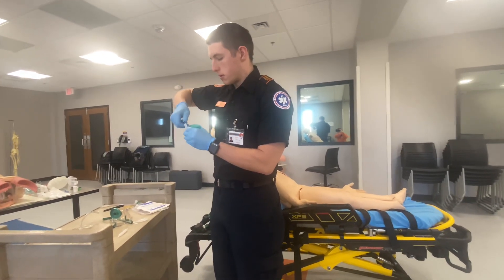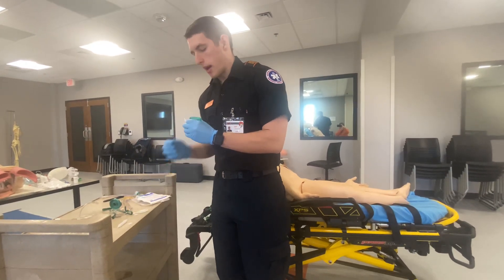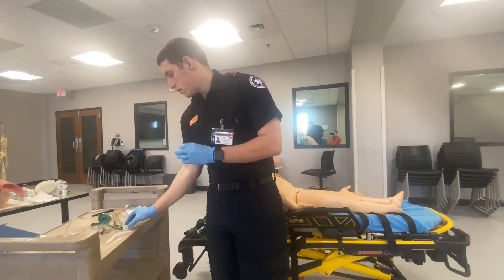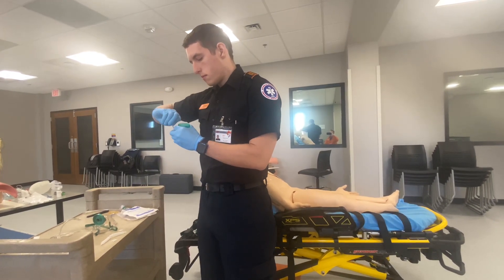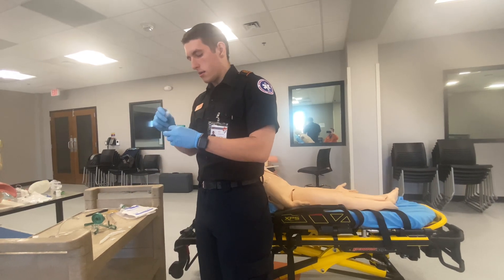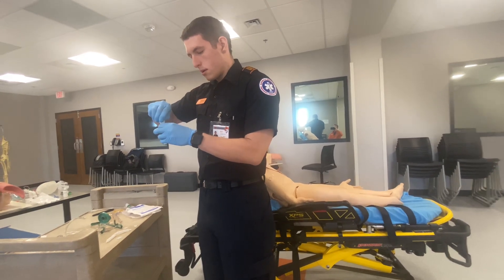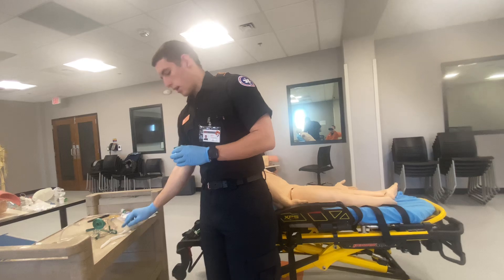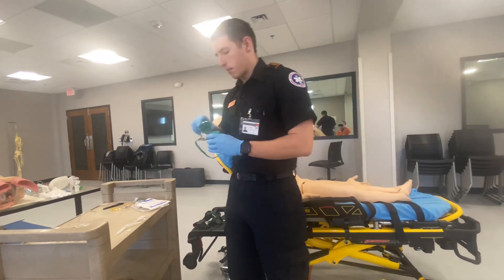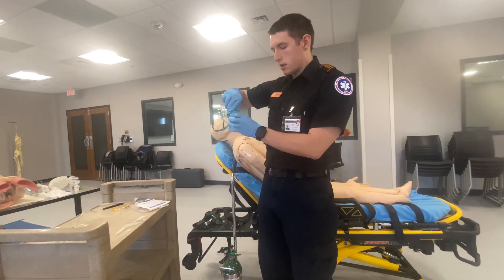Because this is an adult, we use the normal adult dose. If it's a pediatric patient, it's going to be half that. I checked the time, the clarity of the medication, and the expiration date, and I'm going to put this back on.